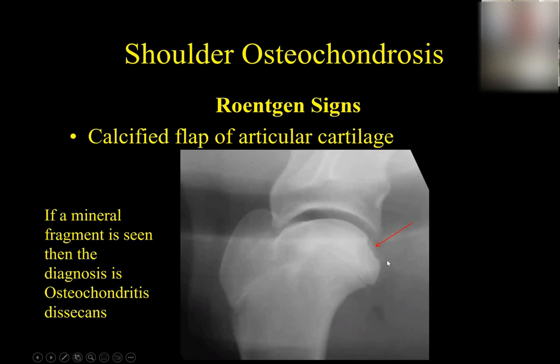Okay. And I'll give you this tip too, and this is in the medical literature. A mineralized intracapsular opacity in the joint space is called, does anybody know the name that people call these inside a joint? It's called a joint mouse. That's in the literature, even the human literature, they call them joint mice.